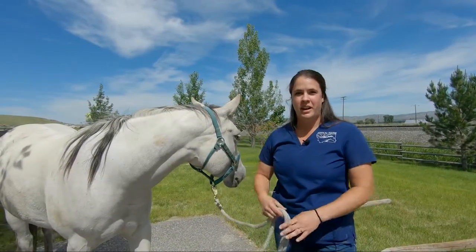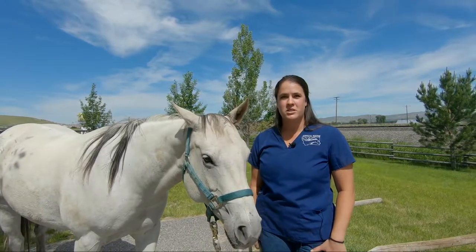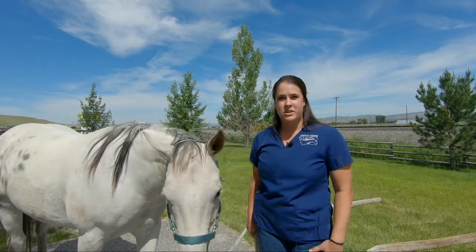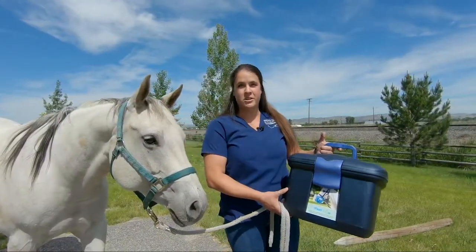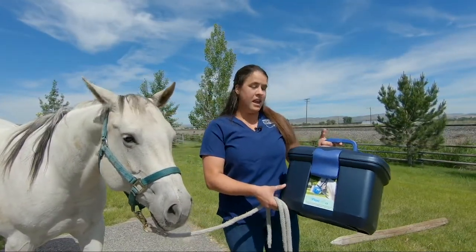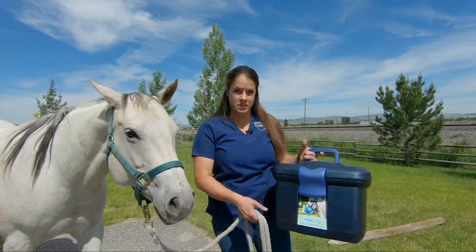Hello, my name is Sirsa Helvey and I am a technician here at Montana Equine. I've been here for about eight years and today I'm going to talk to you about the FlexiNeb. The FlexiNeb is a nebulizer that helps deliver inhaled medication to the horse's upper airway and into their lungs.